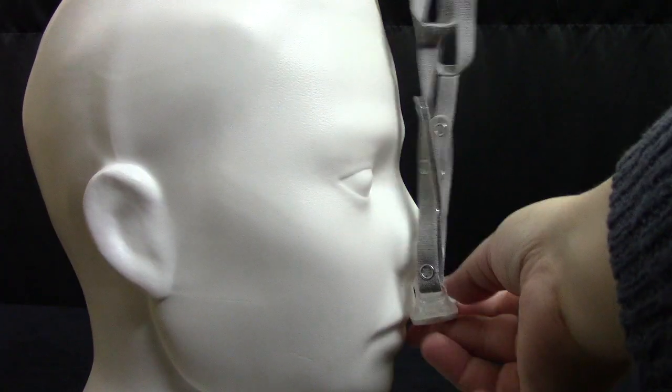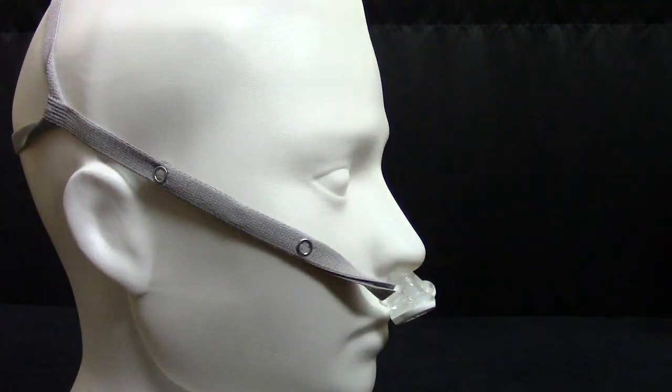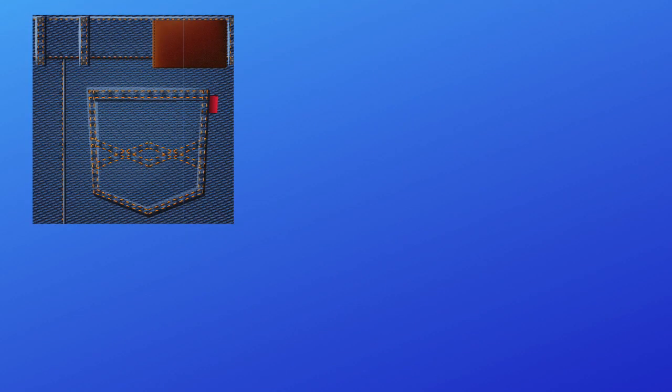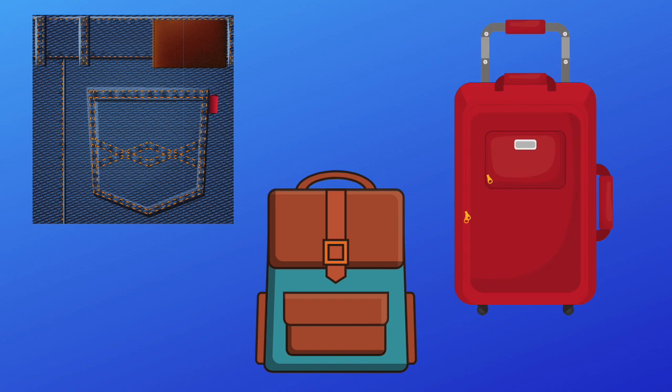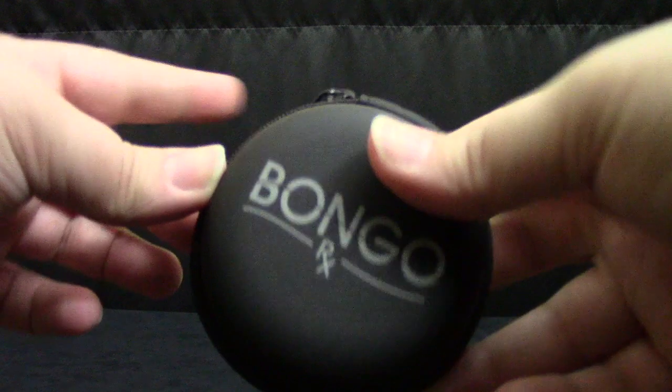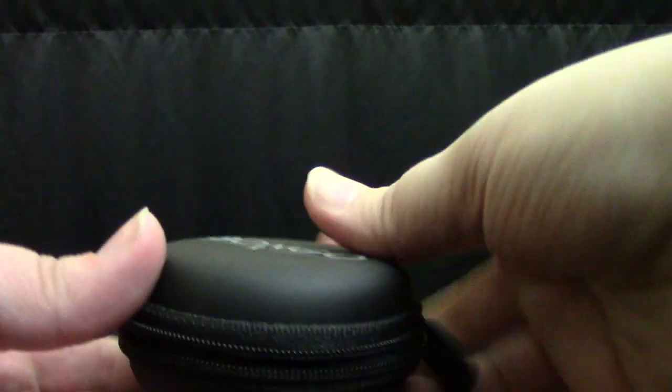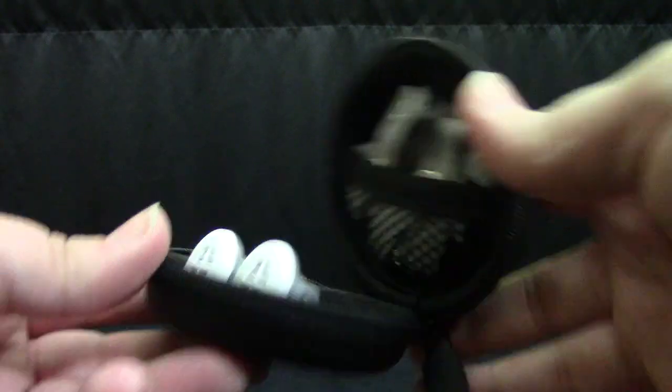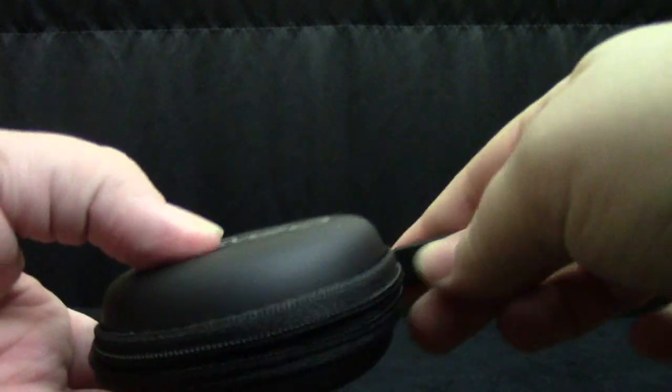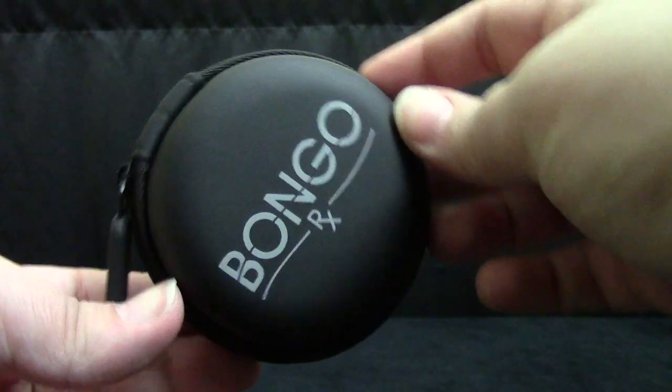Its compact size makes the Bongo ideal for travel. It can be easily placed in your pocket, backpack, or luggage because it takes up minimum space. The Bongo RX also comes with a compact clamshell style case that allows for easy storage. The headgear and the device itself will fit inside.